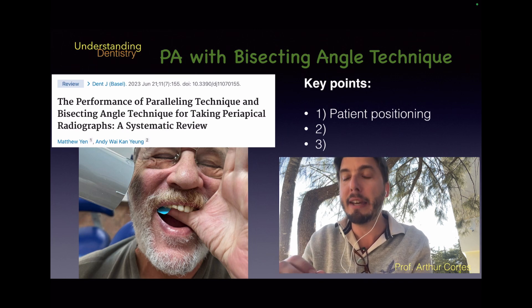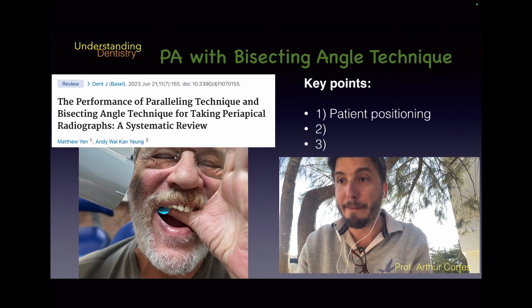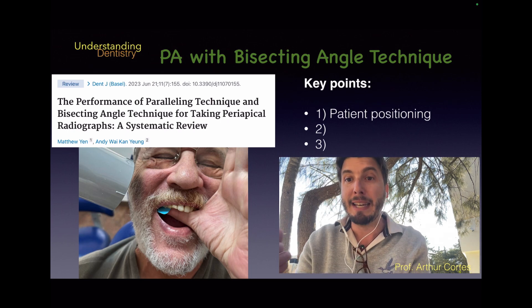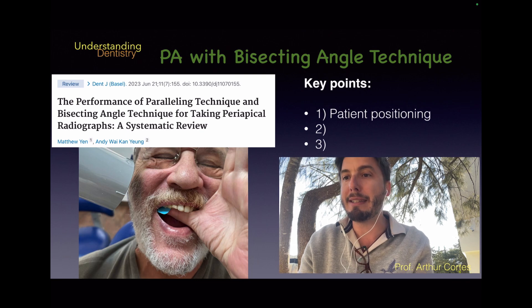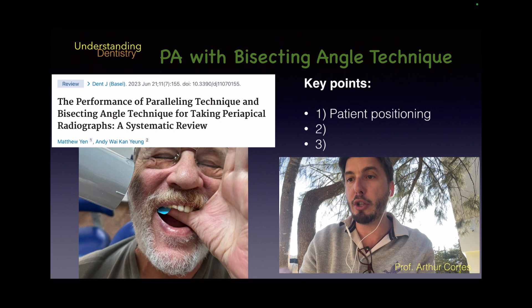There are three main key points here. The first one is patient positioning. You can see the patient is not tilted very much in the dental chair, and the patient has the film inside the mouth. The main rule is that the side of the film, phosphorus plate, or sensor with only one color should be turned toward the x-ray source.